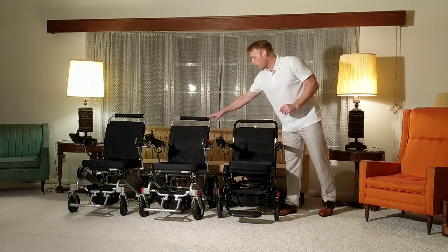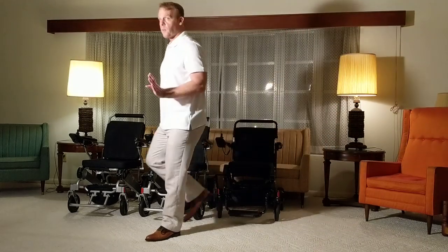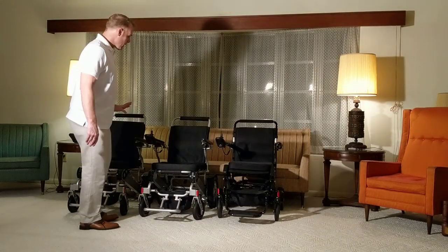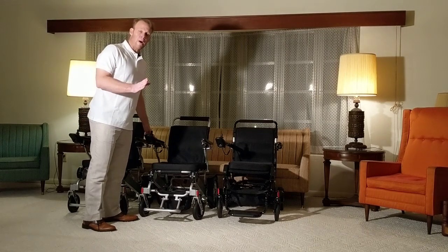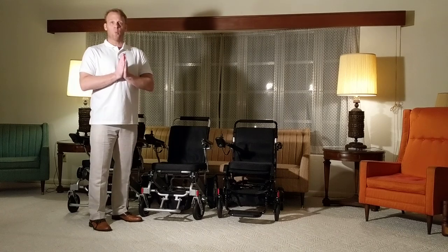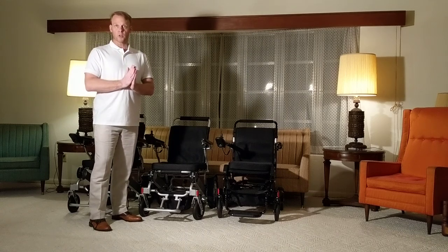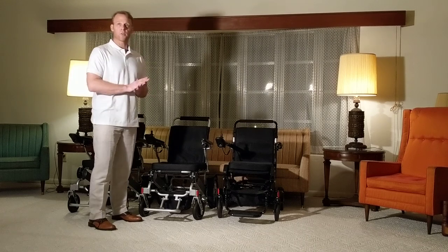The other common chair, at a slightly different price point of $2,587, is the AHXLS folding power chair that was refurbished. A lot of people ask: what specifically does refurbished mean? Was somebody in the chair before me? Was this a chair that was returned?